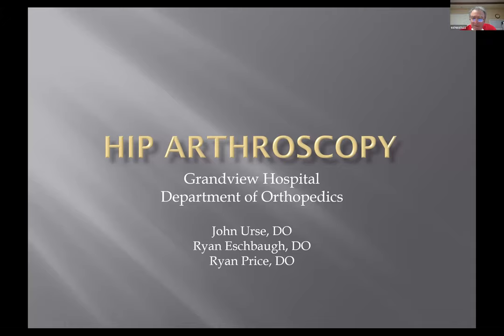About today is my experience with hip arthroscopy and how hip arthroscopy has evolved in the last 20 years. So I will go back to 1991 when I found Gladys Collins's chart, and I did a hip scope on her with knee arthroscopy equipment for synovitis and a little flap of labrum, which I don't even remember how I did the surgery, except it was an old fracture table.